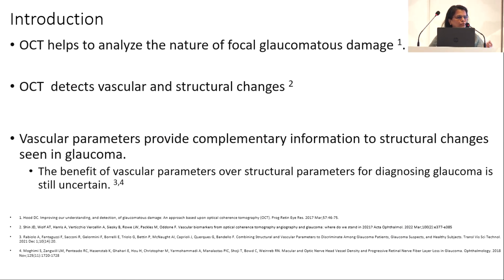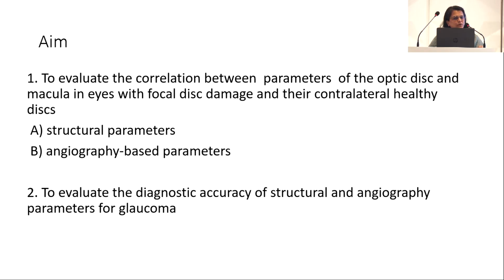As we all know, OCT helps us to detect a focal change, be it a vascular or a structural change. Earlier studies have shown that the vascular parameter does provide complementary information to structural change. However, the benefit of vascular parameter over the structural parameter is still uncertain. So the aim of our study was to evaluate the correlation between the optic disc and macula parameters based on structural analysis and vascular density analysis, and also to evaluate the diagnostic accuracy of the same.